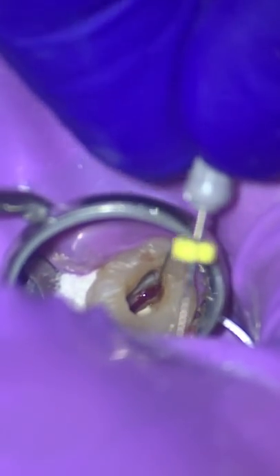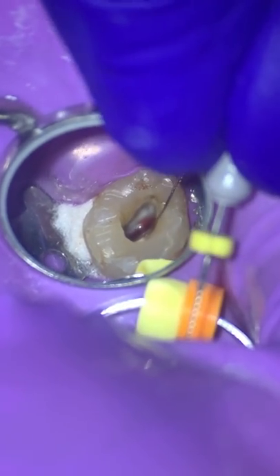And honestly, you hear about tactile sense, it takes a very long time to create that. A very, very long time. I'm not saying I'm an expert at all, but it's taken me many, many years of practice and many years of extracted teeth here and there. Like, oh, that's what that feels like. Oh, that's what that feels like.